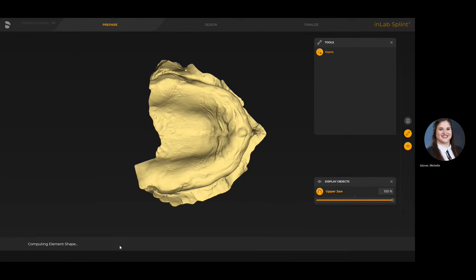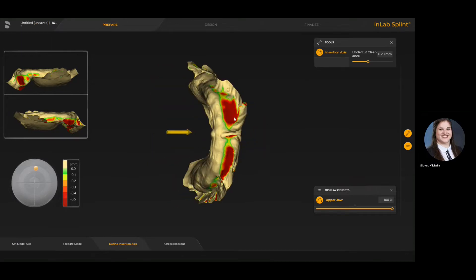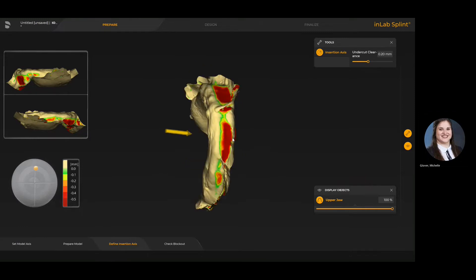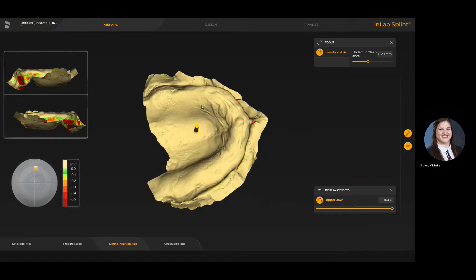In the define insertion axis step we're trying to minimize undercuts. You can see the color mapping on the facial aspect of this particular case — that's basically where the undercuts are present. The legend on the lower left identifies the values of those undercuts based on the path of insertion that we have currently selected with that arrow.